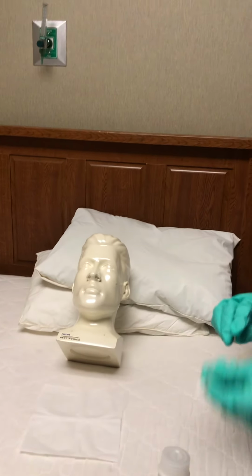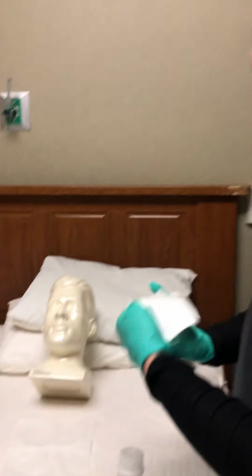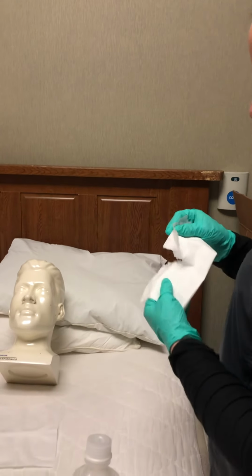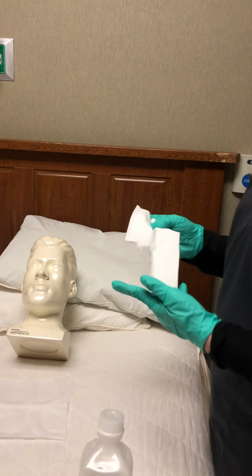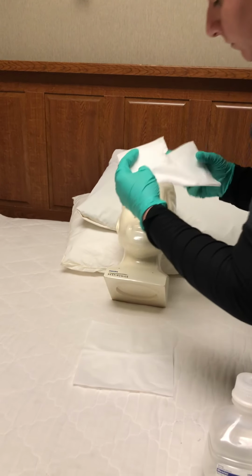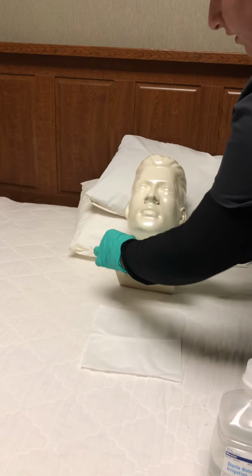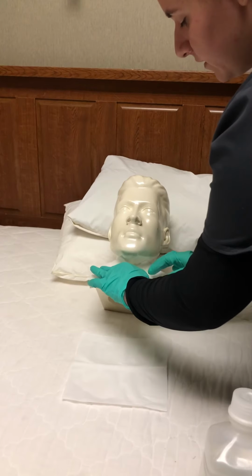And then when you're done with that, I'm just going to use this as my gauze here. You always want to place a new gauze pad underneath the stoma. So you just place it like that, and your stoma just sits there, and then you go around it. You just place it there like that.